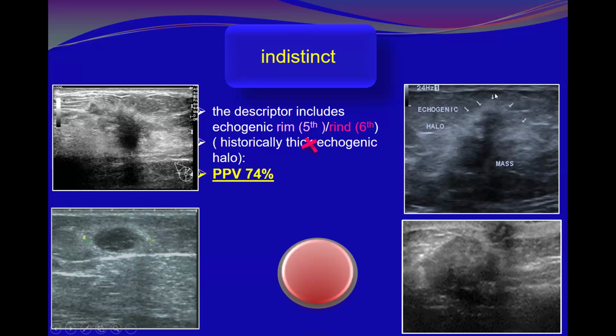Now it is echogenic rim, not necessarily completely surrounding. Here, you have seen it is partially surrounding these lesions. And also this one, partially surrounded by hyperechogenicity. This is my patient, you see, this oval parallel lesion, but it is indistinct and surrounded by a relatively thick hyperechoic layer, making the lesion indistinct.